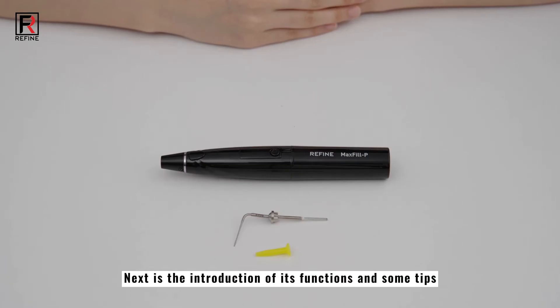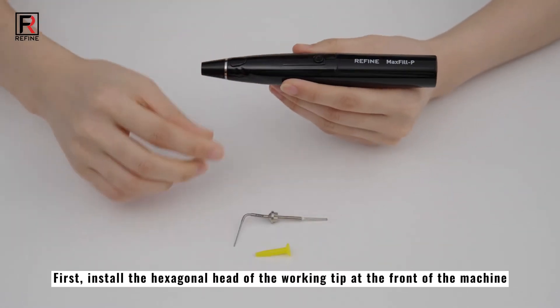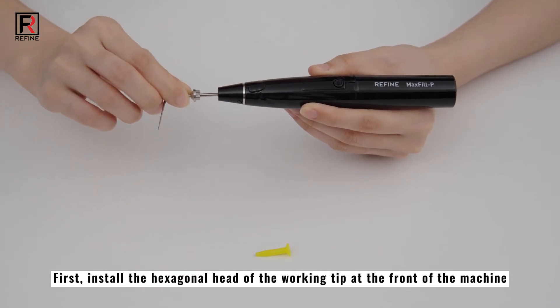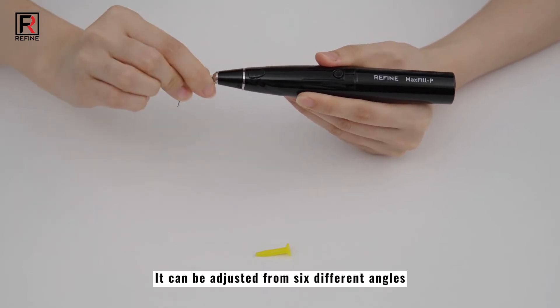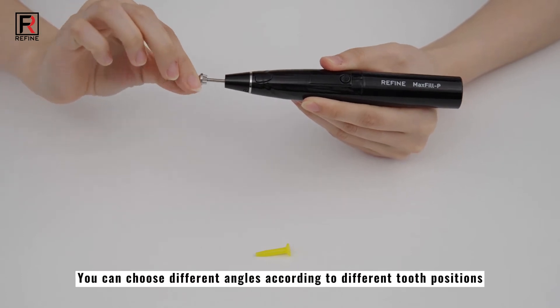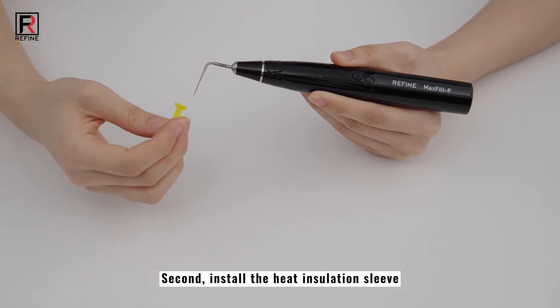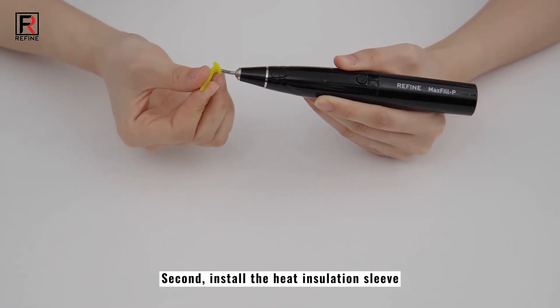Next is the introduction of its functions and some tips. First, install the hexagonal head of the working tip at the front of the machine. It can be adjusted from 6 different angles. You can choose different angles according to different tooth positions. Second, install the heat insulation sleeve.